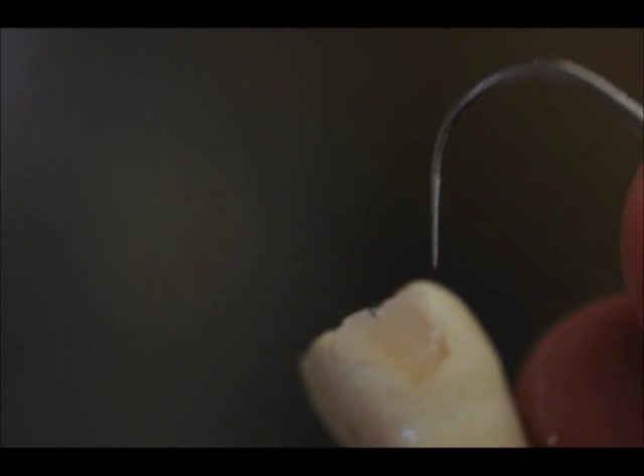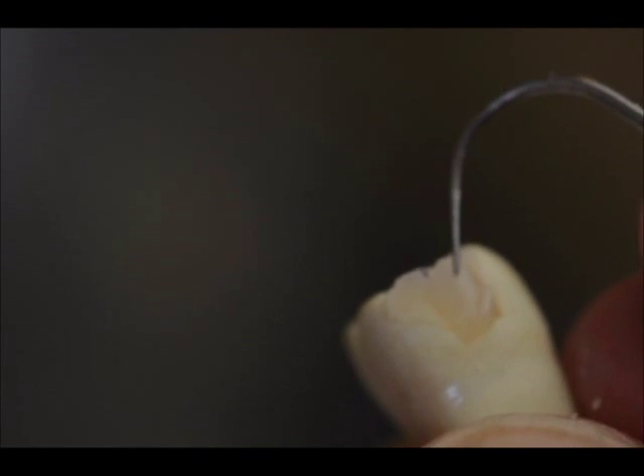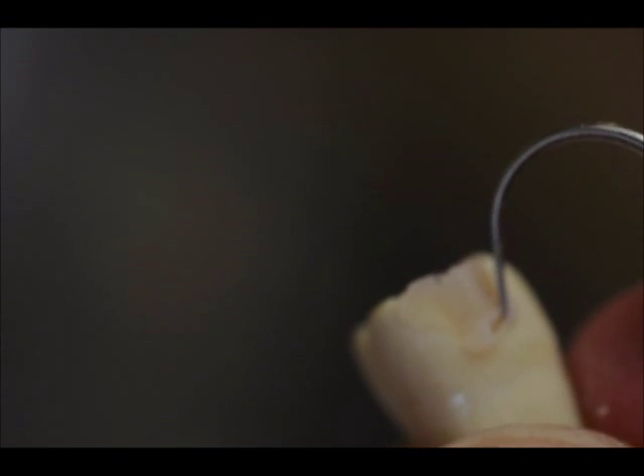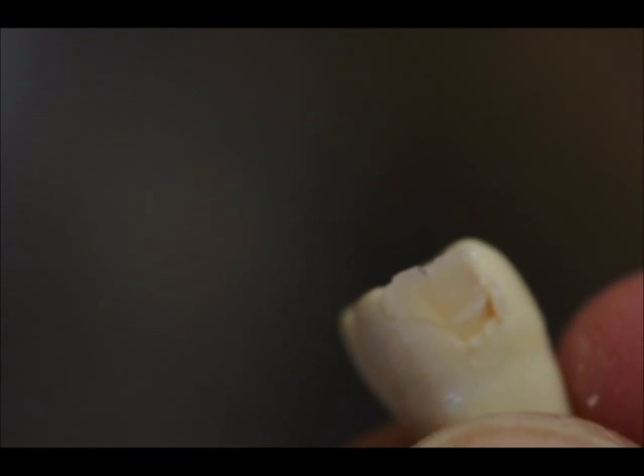You'll see that this particular curing light and composite resin material cures the superficial layers, but when we get down into the deeper layers of the box, we're not curing any of this material. This would have to be cured in layers.